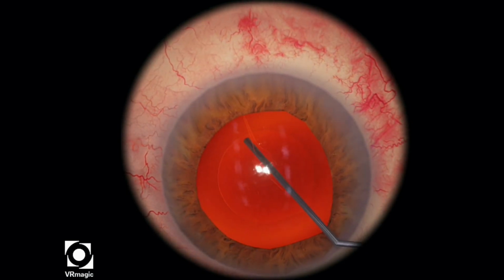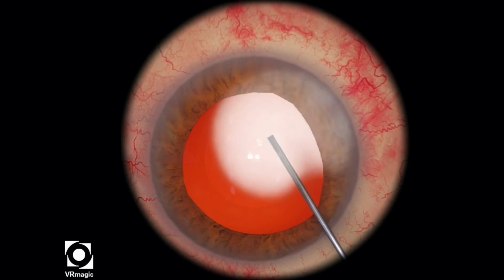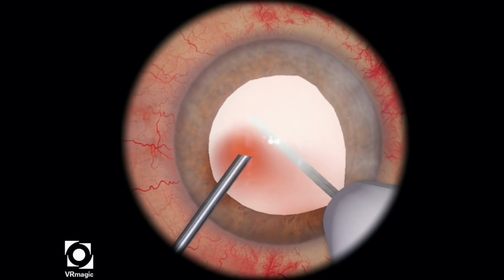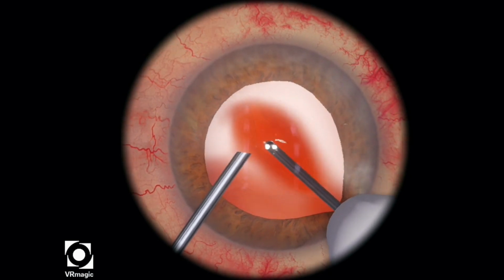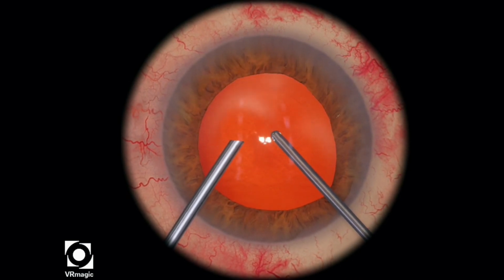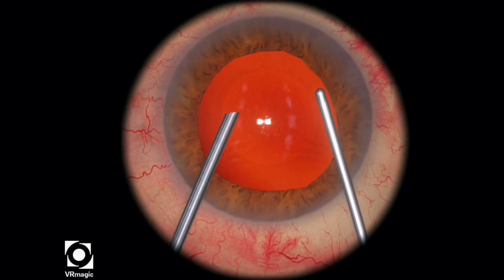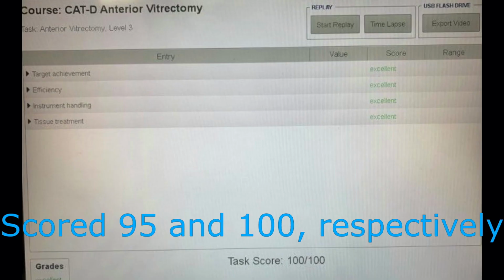So I'm going to stain one more time. I want to make sure that there's no more vitreous. And now I'm just cutting up the rest of the vitreous there. There's still a little bit left there, so I was able to successfully use high aspiration, just pull the vitreous towards the cutter, although in real life you may be worried about cutting the iris.